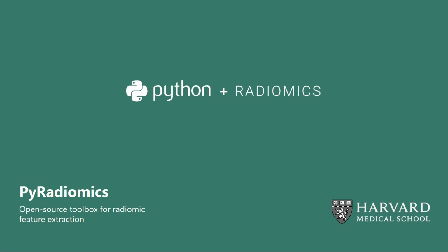Hello, and welcome to this instruction video on PyRadiomics, an open source toolbox for radiomic feature extraction. We'll start with a short introduction, followed by the PyRadiomics workflow and architecture. We will finish with some instructions for installation and the usage examples.